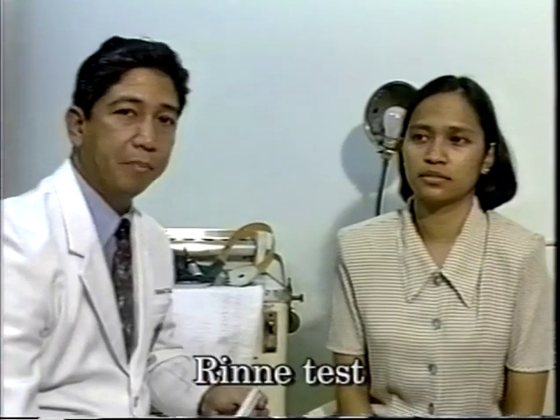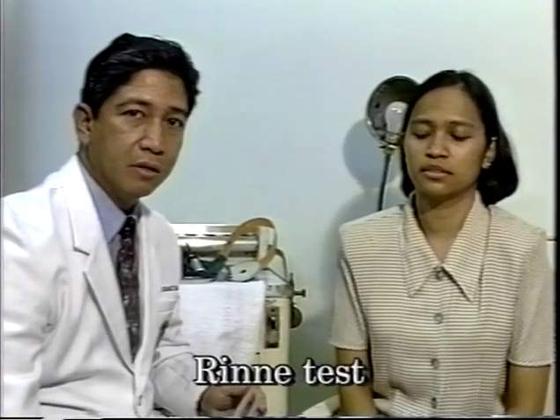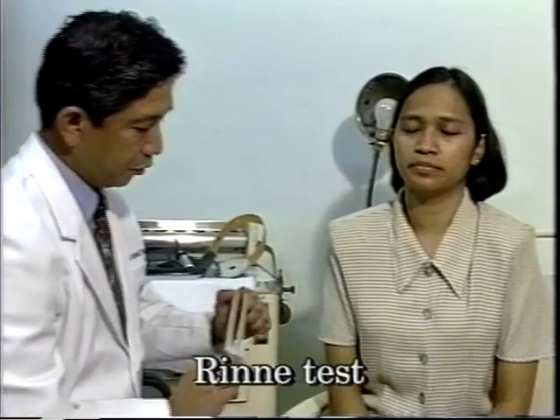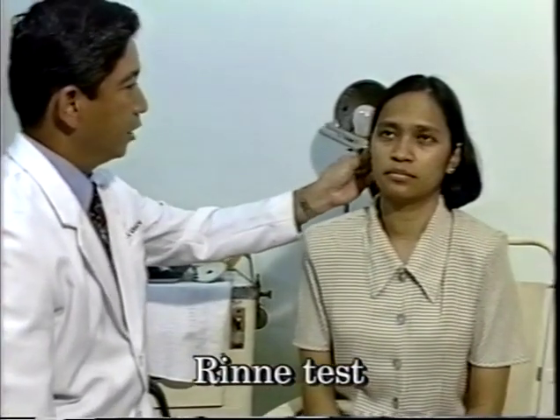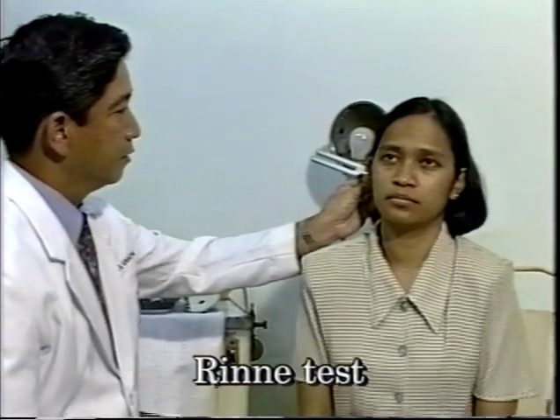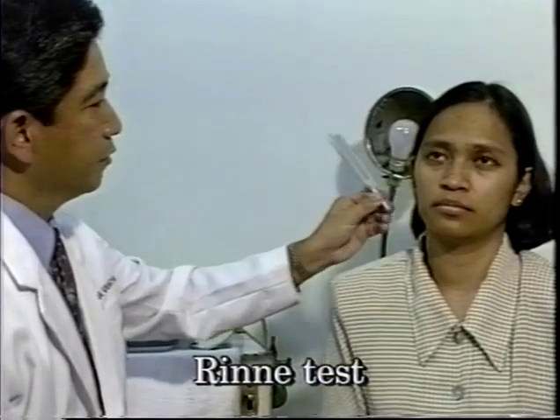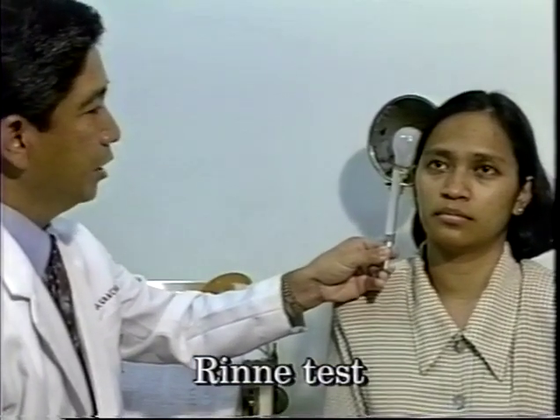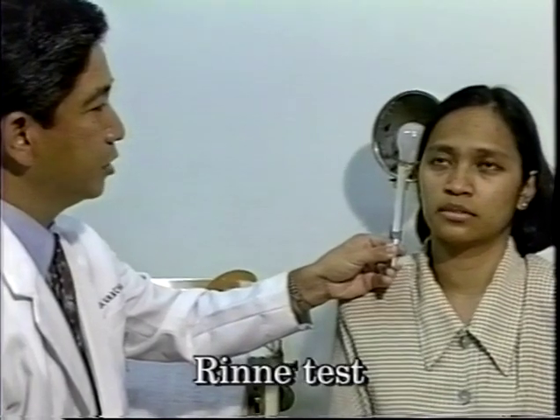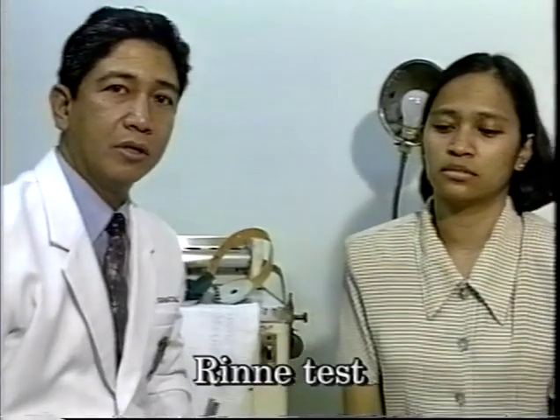The Rinne test is used to compare air conduction with bone conduction. First, you set the tuning fork into vibration and put the base of the tuning fork at the mastoid tip behind the ear. When the patient can no longer hear the sound, you transfer the fork in front of the ear and ascertain whether the patient still hears the sound. Normally, air conduction is longer than bone conduction.